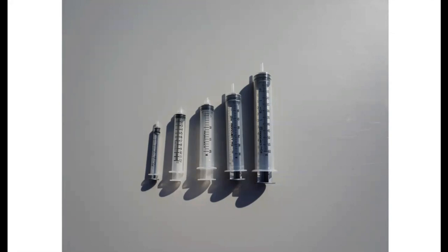So what would be kind of handy to have on an operation? And I'll tell you, I think in a lot of situations having some 60 cc syringes is handy. Not going to be using these for giving multiple doses of vaccine, but if we're treating a cow for foot rot and we're using something like oxytetracycline, depending on what strength of oxytetracycline we're using, it's either going to be 3 cc's or 4.5 cc's per 100 pounds of body weight. The 4.5 is going to be most common. So if it's 4.5 cc's per 100 pounds of body weight, and we're going to be treating a 1,000-pound cow just to keep the math simple, you're talking about 45 cc's of that antibiotic you need to deliver to that cow.